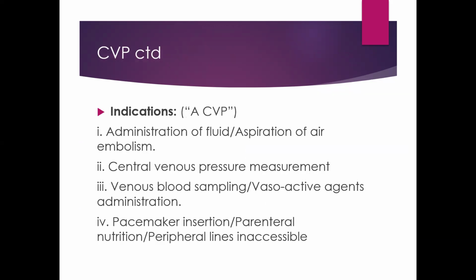So there are different indications. Just to help our trainees, remember the mnemonic CVP, and you provide the full words for it. Administration of fluid, multiple fluid transfusion. Note that it is not ideal for rapid transfusion because of the caliber of the lumen, but for multiple transfusion, a CVP is indicated.